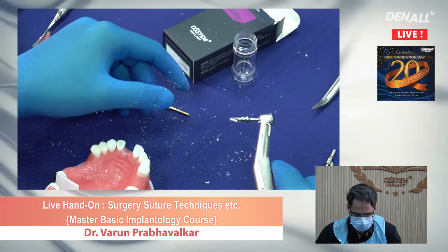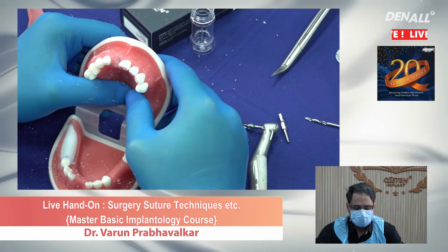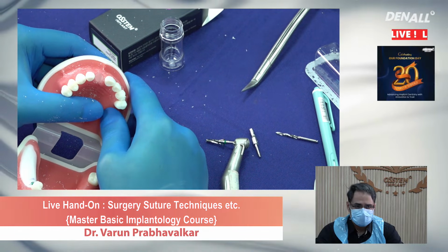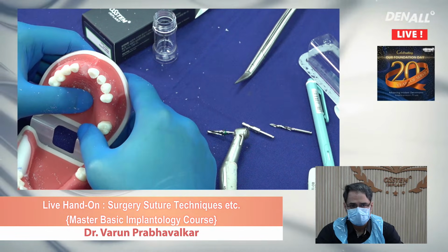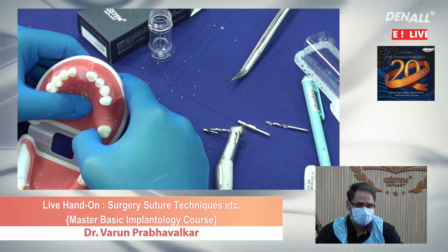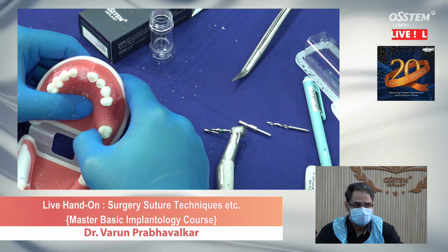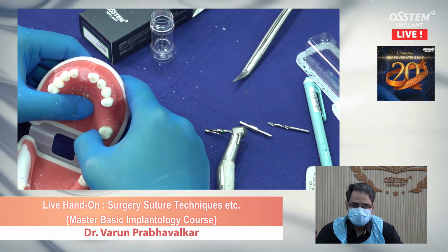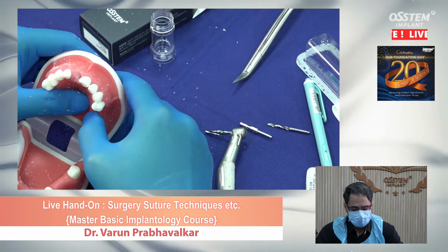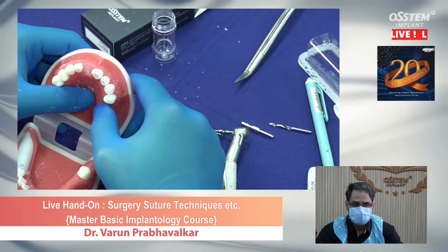Whenever you are doing an anterior immediate implant, or for that matter any immediate implant, it is desired that you get a primary stability. If you want the primary stability in already existing socket, understand that your implant is not going to be 100% inside the bone. It's going to be a certain part of implant which is not going to be inside the bone, because socket is usually always bigger than your implant. And how do we achieve that is by doing under osteotomy or incomplete final osteotomy. Whenever you create an incomplete final osteotomy, you tend to get a good primary stability.